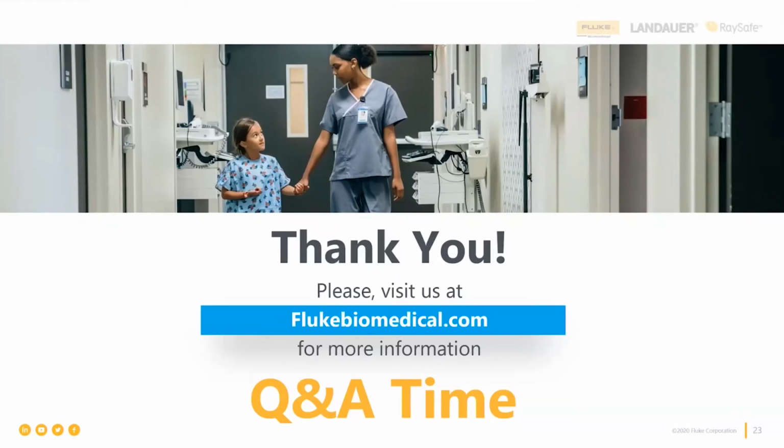One of the things that we used to do when I was in the field is that the pads and the batteries have to be changed out. We said they all have expiration dates on them, right? Mm-hmm. So we would take the pads and the batteries that are just about to expire. We'd always try to change them out before they expire. So if they're going to expire in August, we wanted to change them out in July. And typically, you're doing enough of these after a while that you can collect a few of those pads and batteries. And that's what we would use. So we weren't wasting money buying a brand new battery and brand new pad. You're getting ready to swap them out. That's a great time to use them up.